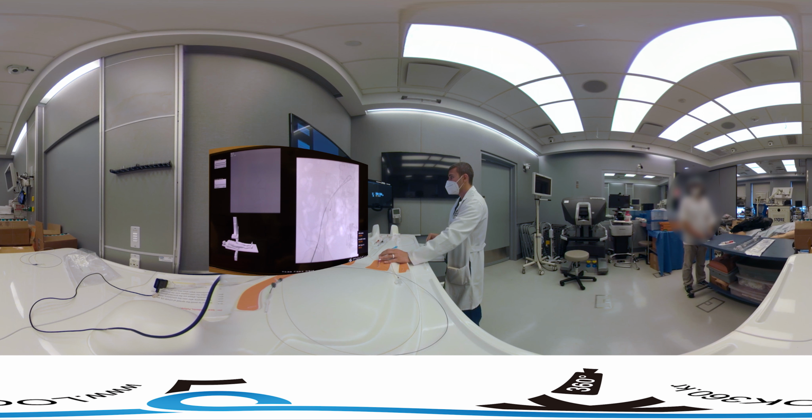I'm going to do a different oblique now. So we'll do an RAO oblique. And then we'll do a run right here. So we're going to do a DSA. Holding this down, we'll do an injection. We get a nice picture there showing us where the uterine comes off.